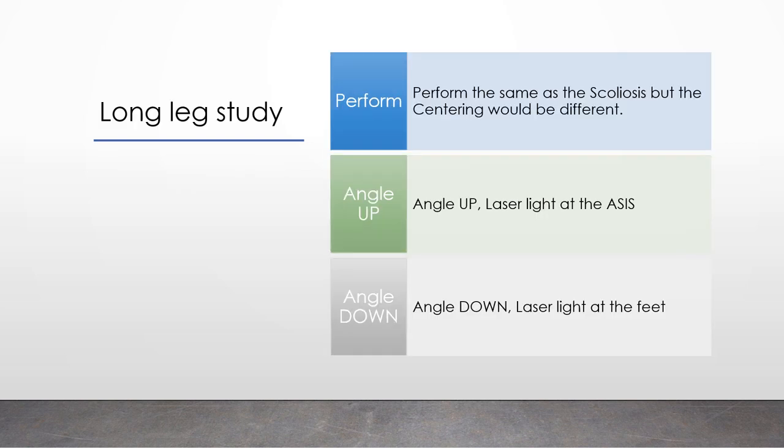Long leg study. You'll perform the same as the scoliosis, but the centering will be different. Angle up so the laser light is at the ASIS. Angle down so the laser light is at the feet.